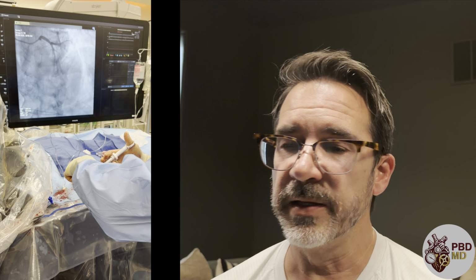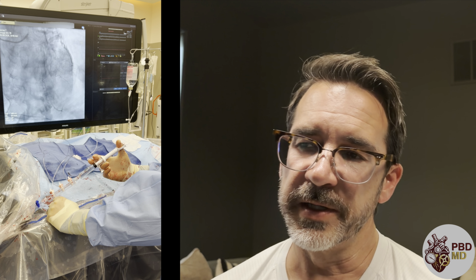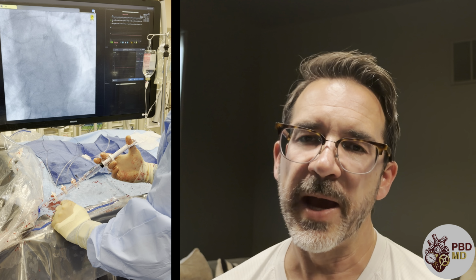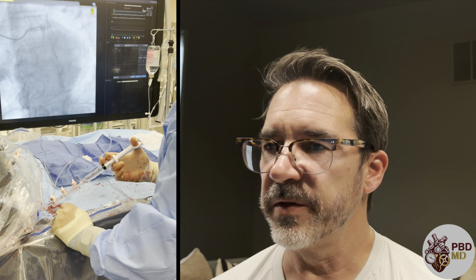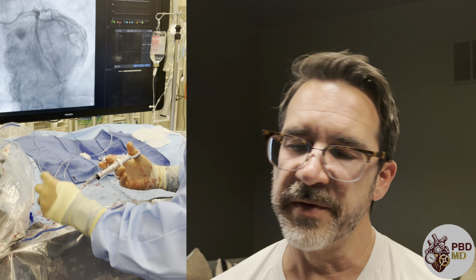Of course, with anything, there are situations where the worst thing that can happen in a procedure like this, from a pain standpoint, is getting spasm in the arm, in the blood vessels. Sometimes the blood vessels are kind of small relative to the catheter size, and the vessel clamps down. That can be painful. We treat that with medications, and usually it's not too big a deal.